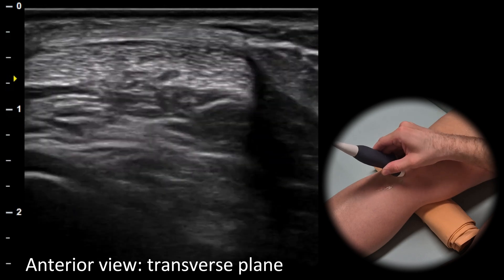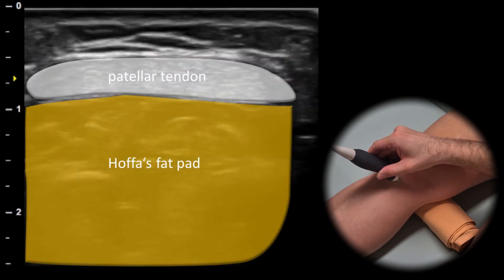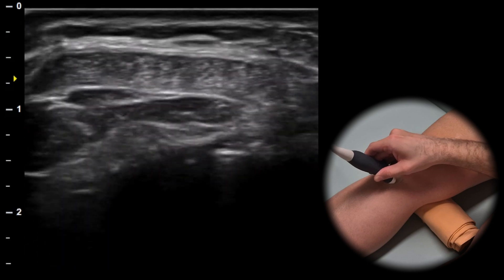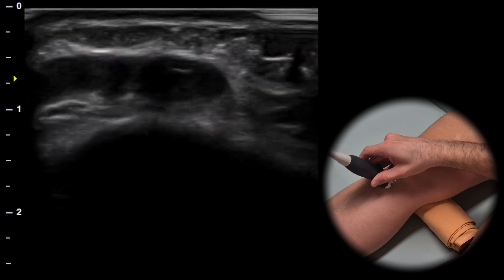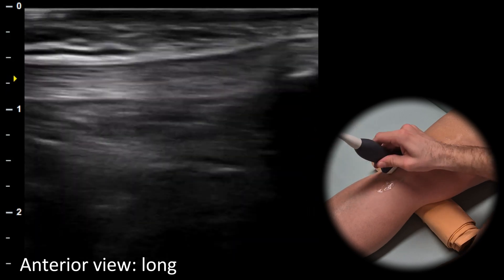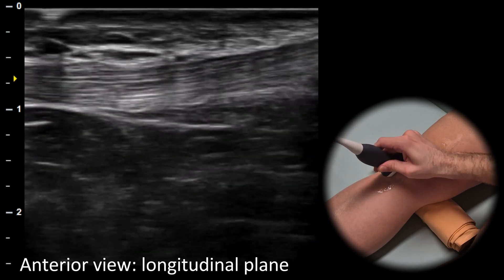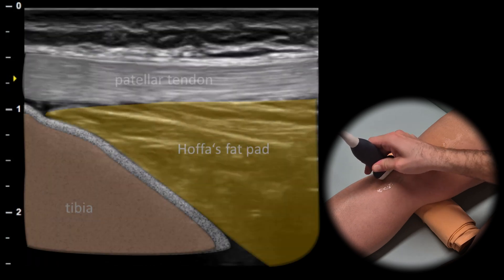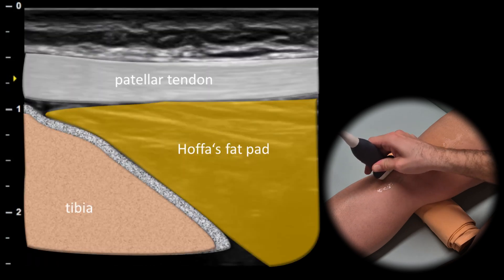When we move to the infrapatellar area, in the transverse plane we can evaluate the patellar ligament in its short axis. By rotating the probe by 90 degrees we can assess the patellar ligament in its long axis and its attachment to the patella and tibia. Beneath the patellar ligament we can visualize HOFA's fat pad.